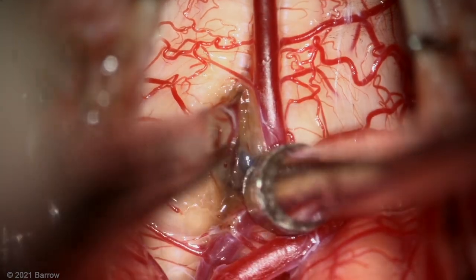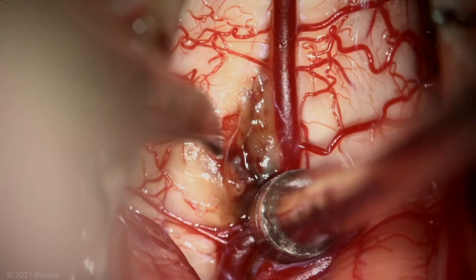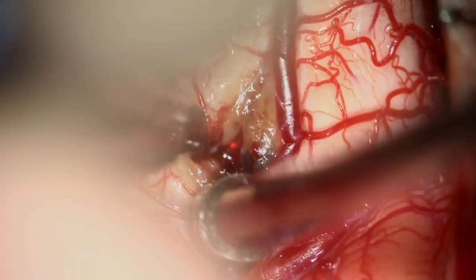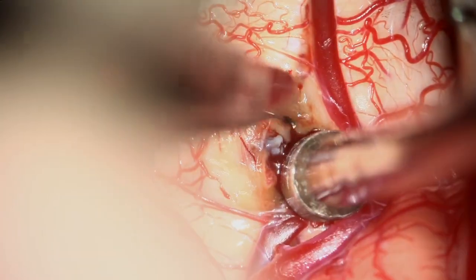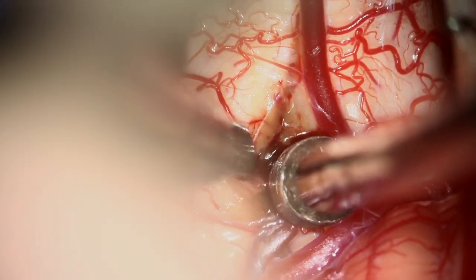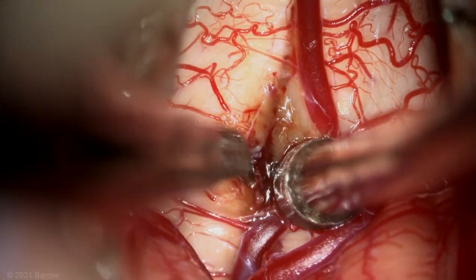Here the incision is being extended inferiorly, and now with a little sharp dissection we enter the malformation and drain some blood. This drainage of blood is meant to collapse the malformation, to take out whatever fluid is within it, and to gain some space between the malformation and the capsule.